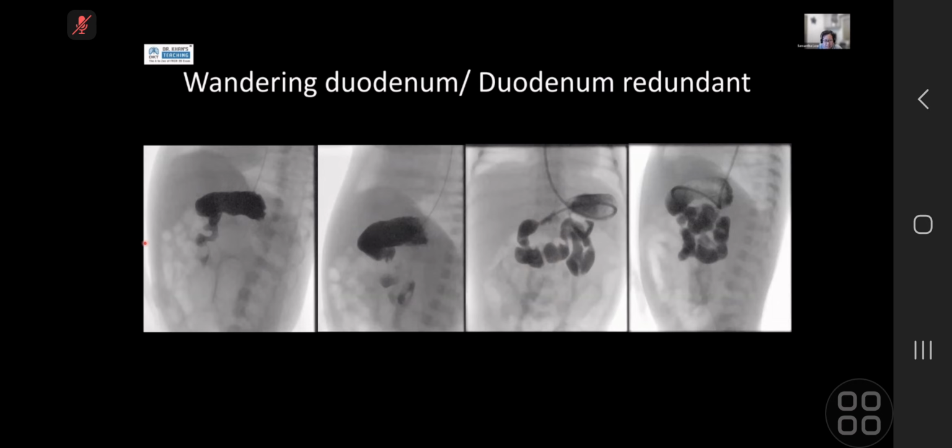Some of you may wonder, is this volvulus? As I said, we need 2 views. You don't know at which point this patient's fluoroscopy is done. Is that enough? Because it's a dynamic study, you do have to wait and watch all the contrast. Still shots are often not the best way of demonstrating, and you really need to be there to watch it. After seeing that, you can see the DJ flexure is in the right position after a bit of a wobble within the loop. Later on in the study, you really don't see any evidence of volvulus, with nice filling of the distal bowel loops. Okay. The other one is a duodenal inversum.